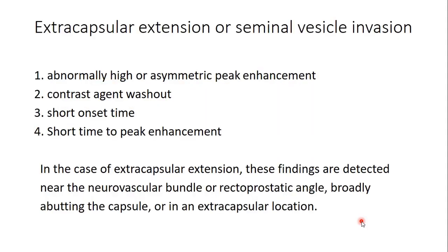Extracapsular extension or seminal vesicle invasion. On dynamic contrast enhancement, abnormally high or asymmetrical peak enhancement, contrast agent washout, short onset time and short time to peak shows seminal vesicle invasion. Similar findings if detected near the neurovascular bundle or rectoprostatic angle shows extracapsular extension of the prostate CA.